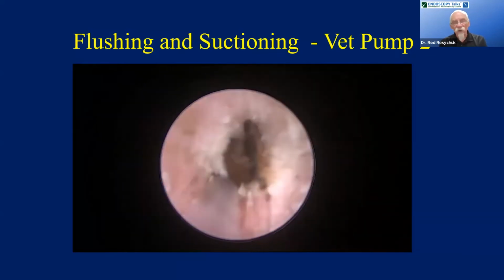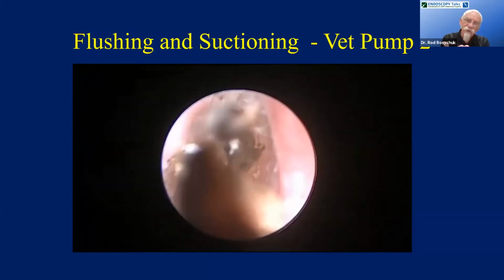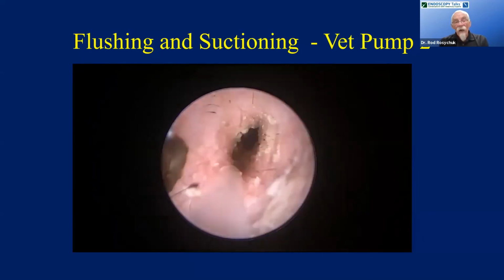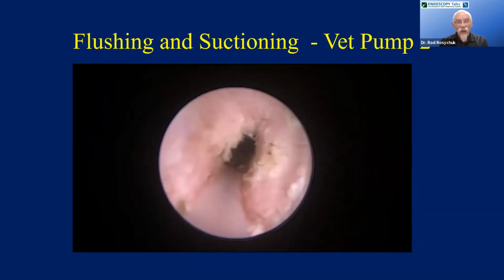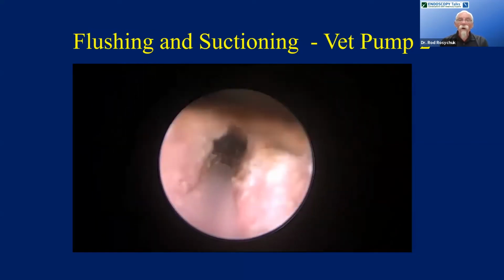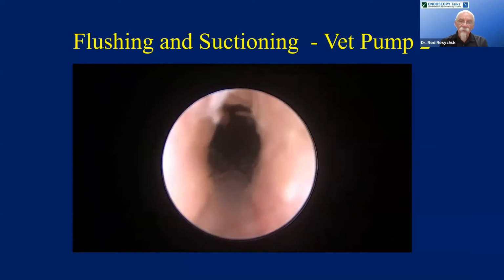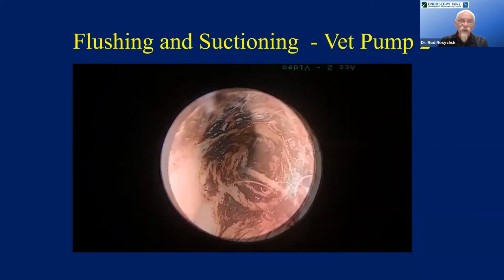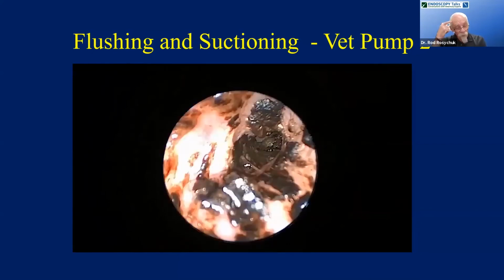You flush and flush and flush. You keep the flush running through that ear. And the bottom line here is give it time. This material has been lodged in these ears for 2-3 years sometimes. It takes time to move it out. Oh, you can barely see this eardrum. That's an intact eardrum way down there.